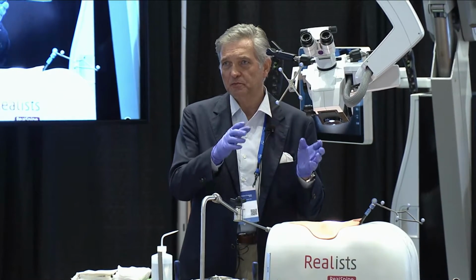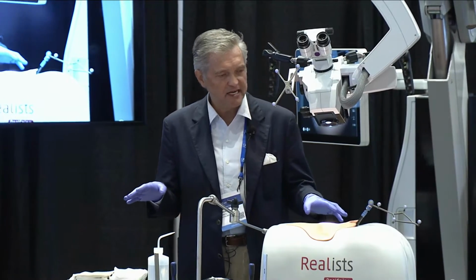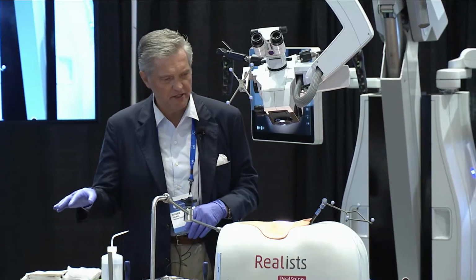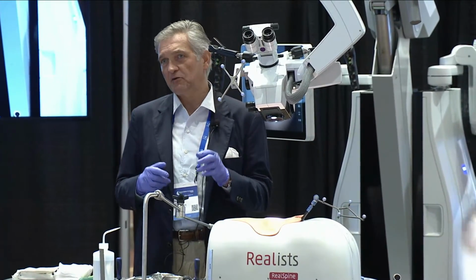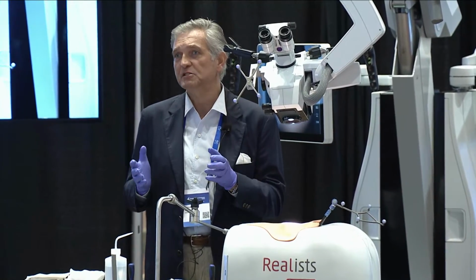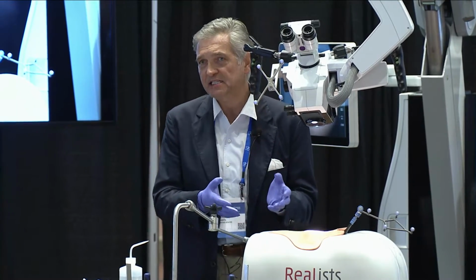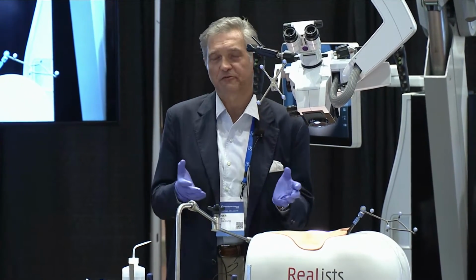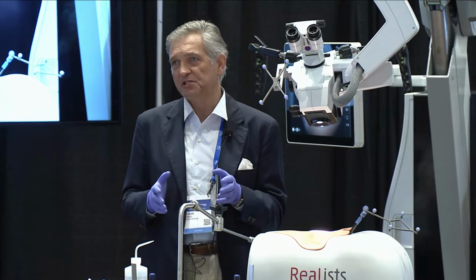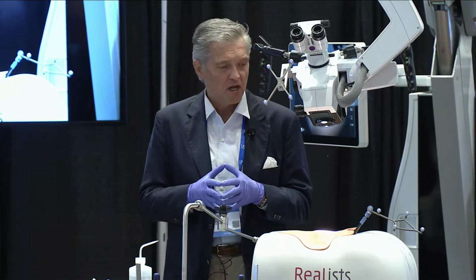So what I'm going to show you is a TLIF on the right side at L4-5, and we're going to use the microscope navigation. In terms of the setup, the patient is positioned on the table, the legs are to my left, towards your right side, the head is over here. Because I use navigation, I always make sure that we tape the patient to the table, so there's very little motion. That helps you with accuracy because I rely on the accuracy of navigation since there's no fluoroscopy, right? So I want to make sure I really maximize the ability to maintain accuracy of navigation throughout the procedure, and taping the patient helps with that.